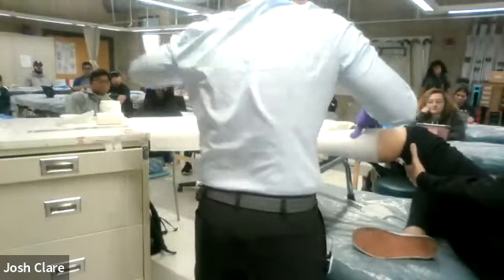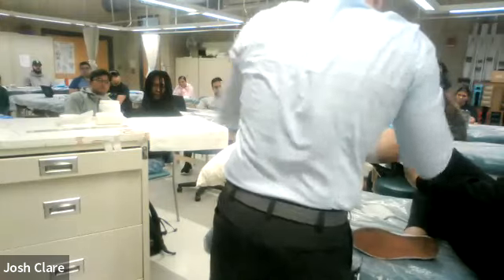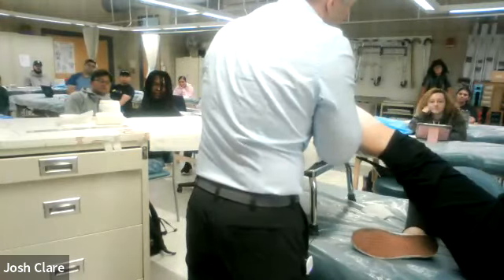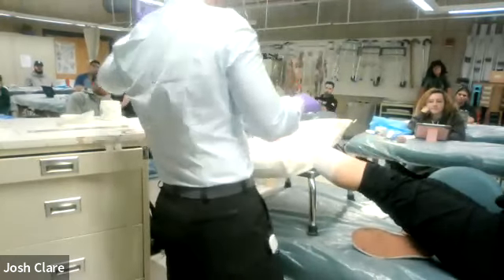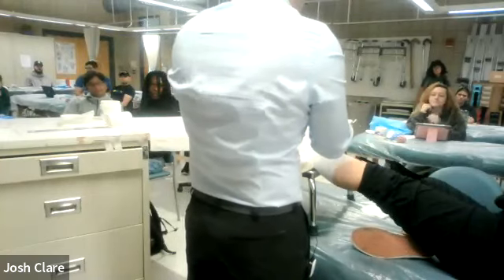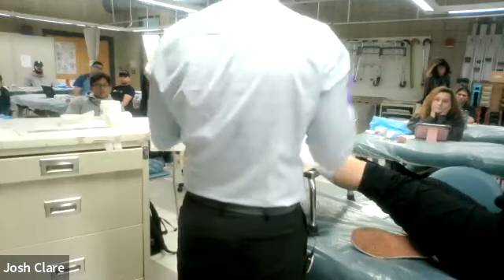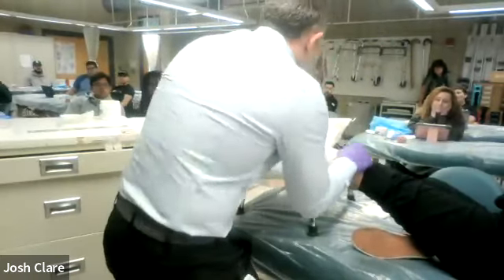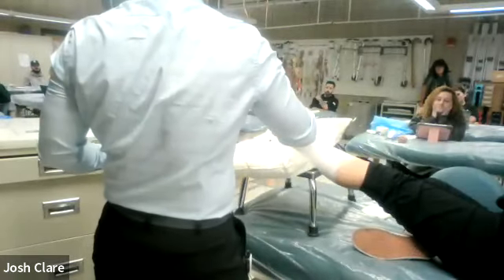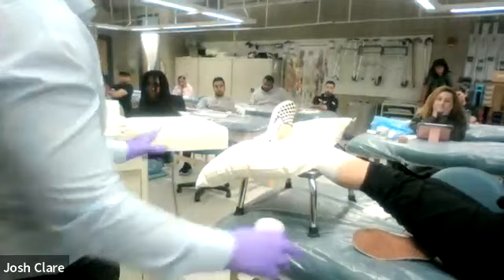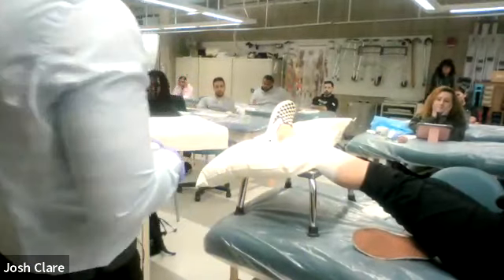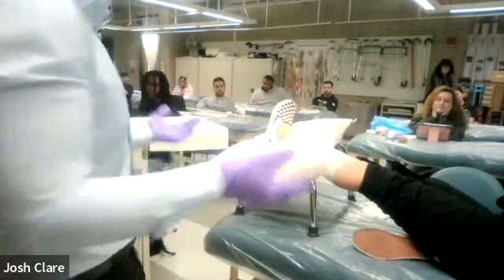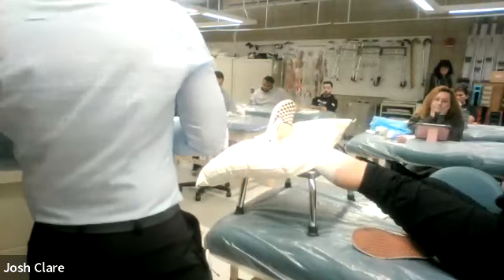When you've done a really nice job, all the intersections of those X's are going to line up — it'll take some practice. Next I take a look — do I need to fix anything? Here's a little wrinkle — got to fix that. I'm unhappy with my first course; it got really loose over here. I'm not going to live with that — I'd have to take it all the way down. Just like with positioning, before you leave, take a look back and see if there's anything else you need to do. Next up is the ace wrap — all the same rules apply.